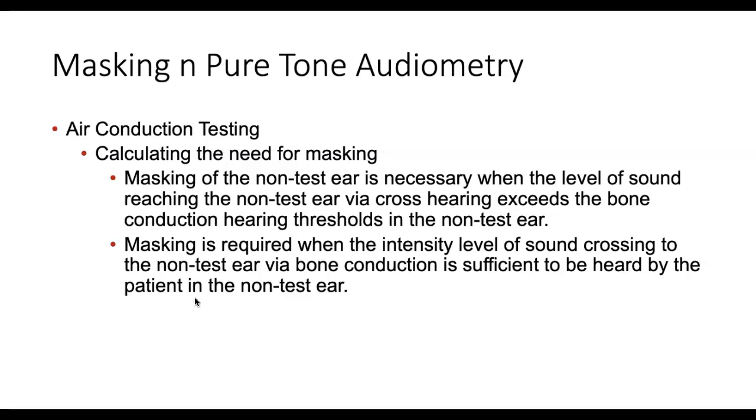Now, I'm not going to have you really calculate the need for masking, but essentially masking of the non-test ear is necessary when the level of sound reaching the non-test ear via cross-hearing exceeds the bone conduction hearing thresholds in the non-test ear.